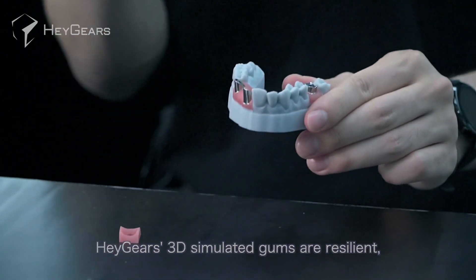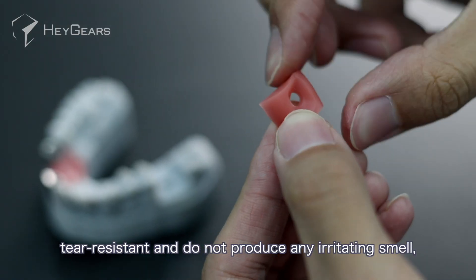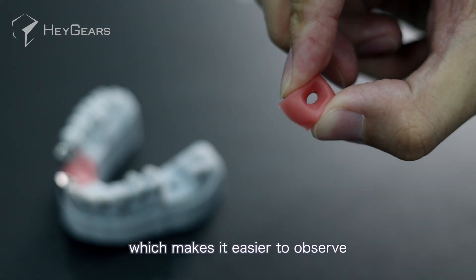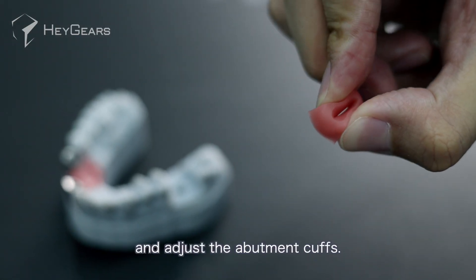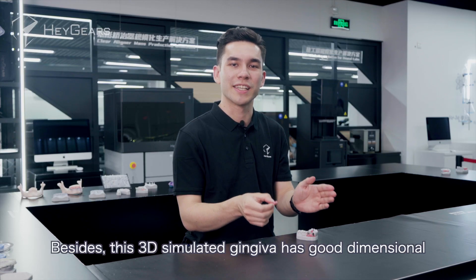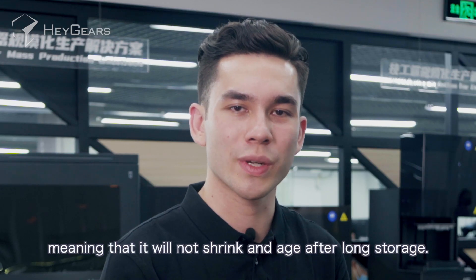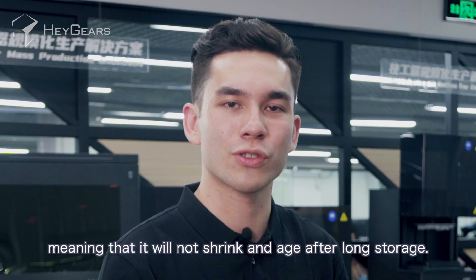Hager's 3D simulated gums are resilient, tear resistant, and do not produce any irritating smells, which makes it easier to observe and adjust the abutment cuffs. Besides, this 3D simulated gingiva has good dimensional and performance stability, meaning that it will not shrink and age after long storage.